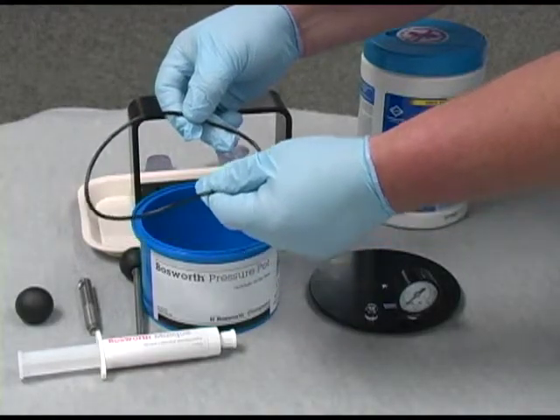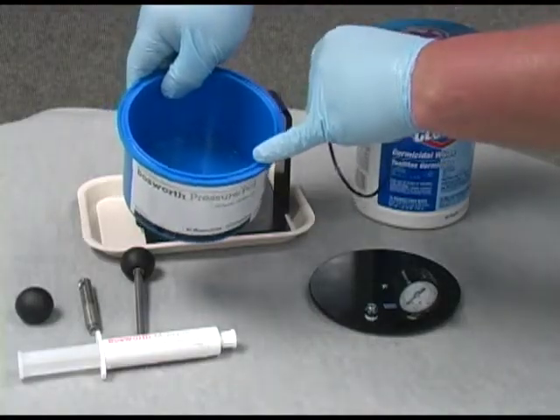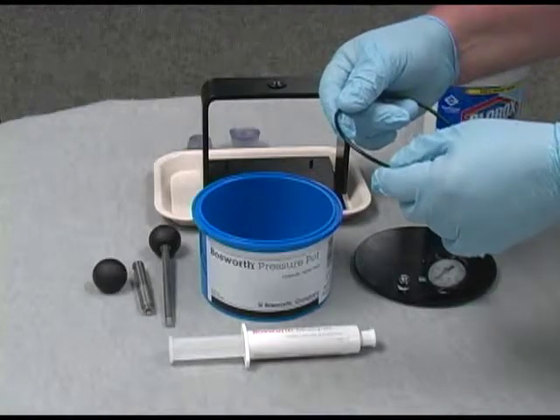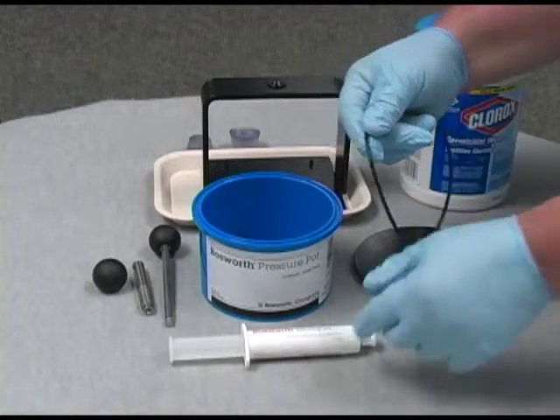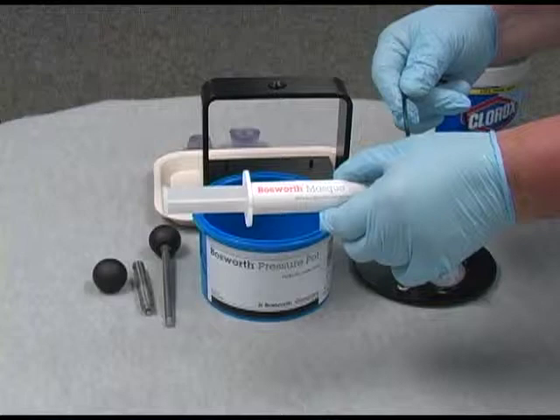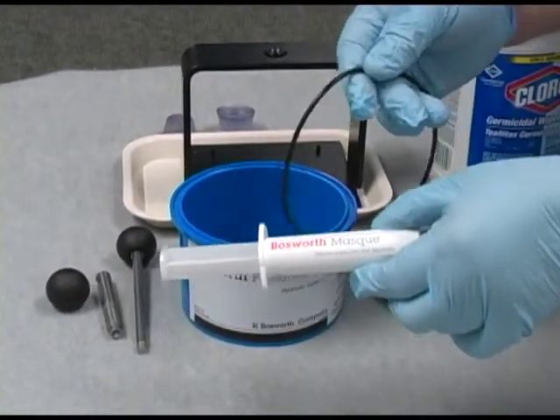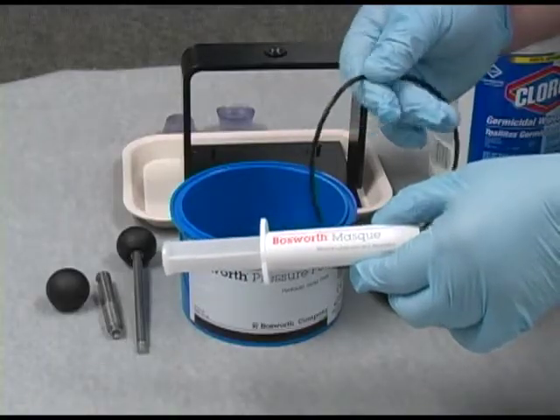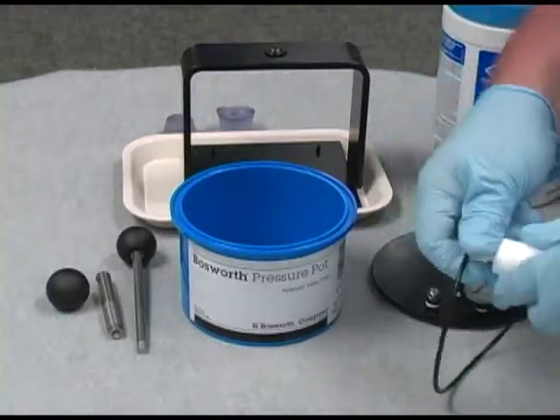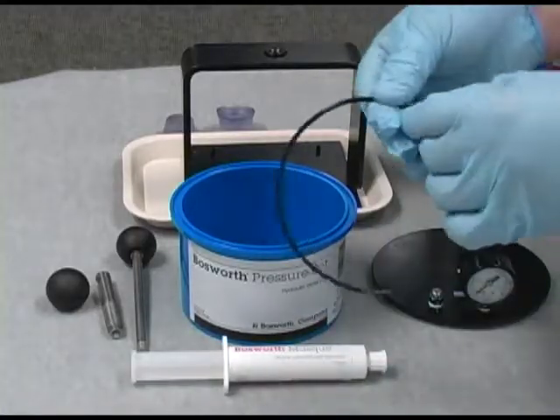The o-ring gasket is to be placed in the appropriate groove on the pressure pot. Lubricate the o-ring on a regular basis with Bosworth Mask. Mask is a lubricant and separator agent that will not harm the rubber, but will keep the gasket lively and prevent it from drying out over time. Simply place a small amount of Mask on your finger and lubricate the o-ring.